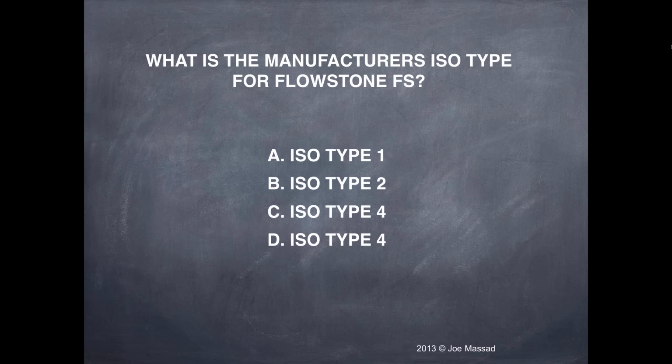A lot of the existing containers we have now, you can build them, stack them, but then how do you lock that in to make sure that no liquid goes through it? You have a bottom container, then you can make it a little bit taller by stacking little parts. But those have to be all seamed together, because when you pour this, it's like water. It'll find any crack there is. So this was so simple, just to use a container.